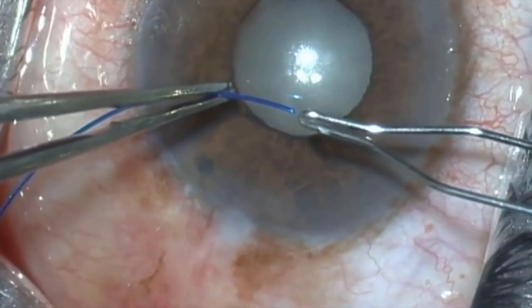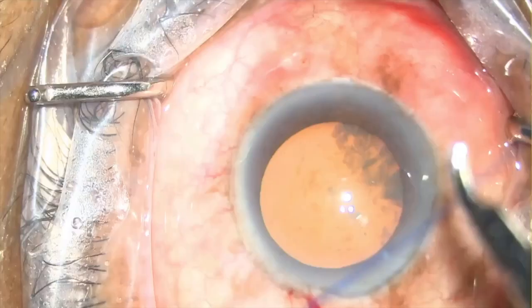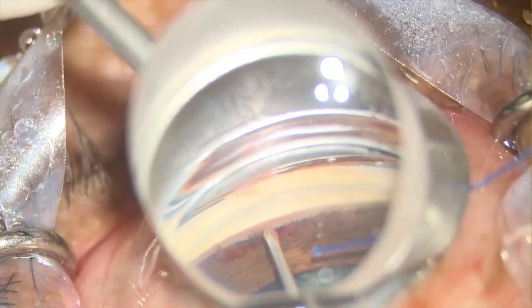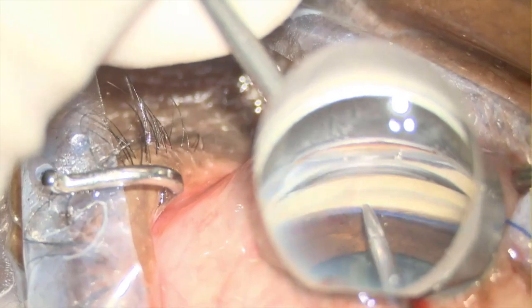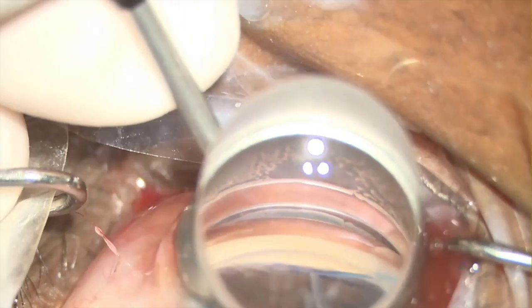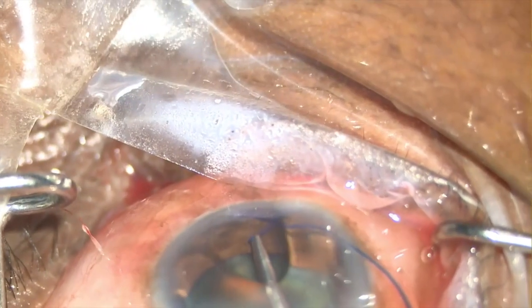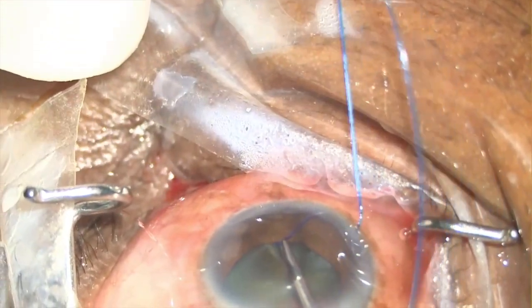An ideal suture GATT surgery involves the blunting of the tip of a 5-0 Prolene suture using a low-temperature cautery to make a small flange. Following this, the suture is introduced into the anterior chamber under OVD. A small 1 clock hour initial goniotomy is made in the trabecular meshwork using the 25 gauge MVR blade, and then the flange suture is introduced into Schlemm's canal using MSD forceps under Swan-Jacob gonio lens visualization. With gentle strokes, the Prolene suture is advanced into the canal till it appears from the opposite side, where it is grasped at the tip, above the initial suture, and brought to the center of the anterior chamber. Finally, using McPherson's forceps, the external suture is pulled out, achieving a 360-degree ab interno trabeculotomy.